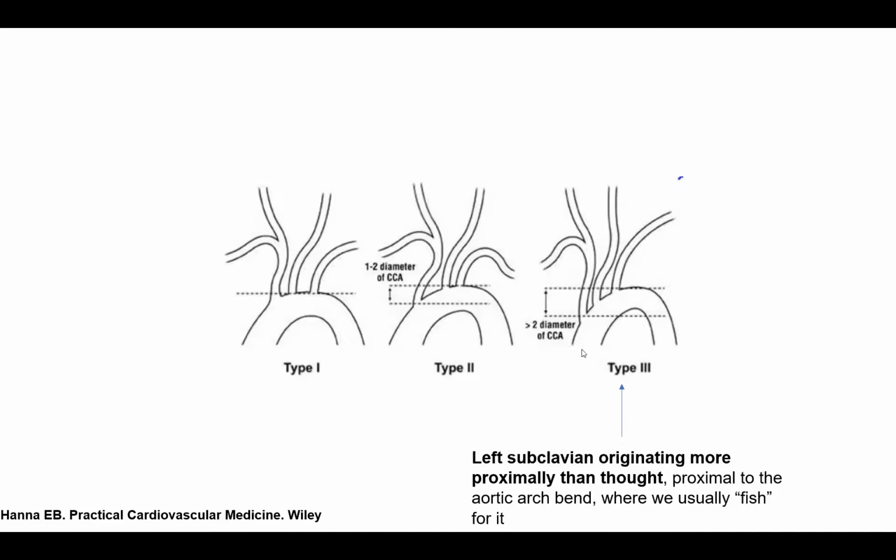But on occasion, the aortic arch is so steep that when you're maneuvering in the horizontal portion of the arch, you're already past the subclavian and past all of those vessels. So you keep pulling with a counterclock, aiming for the subclavian here, while you're already too distal. Whenever you have difficulty engaging that subclavian, think, I'm already too distal. I should try on the ascending portion of the aorta.